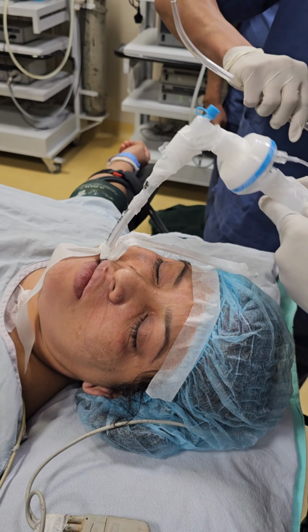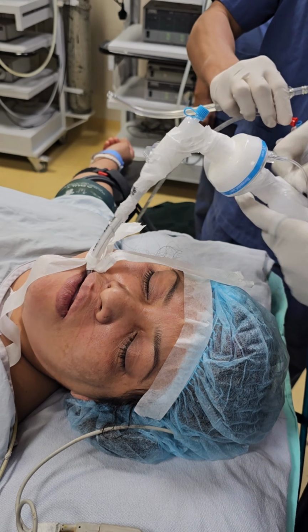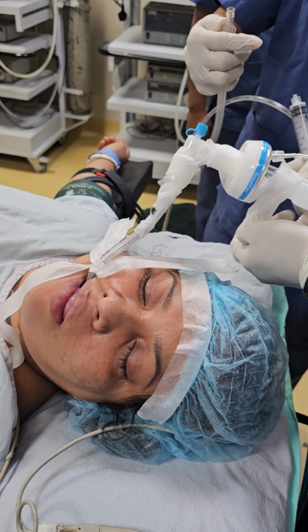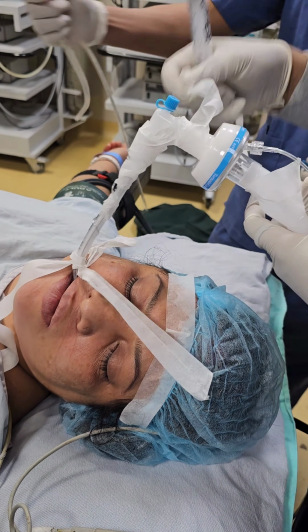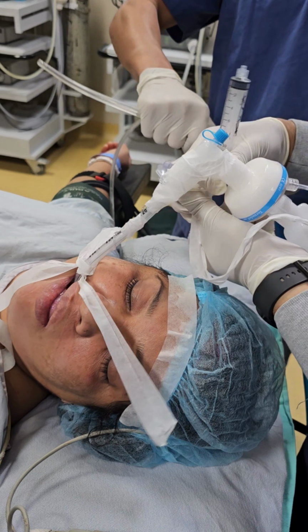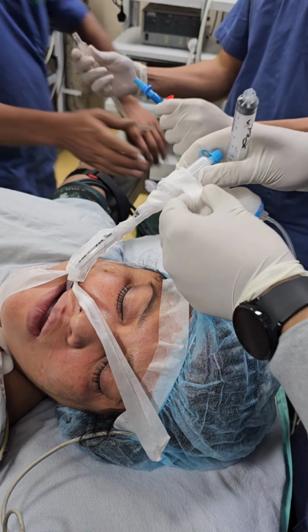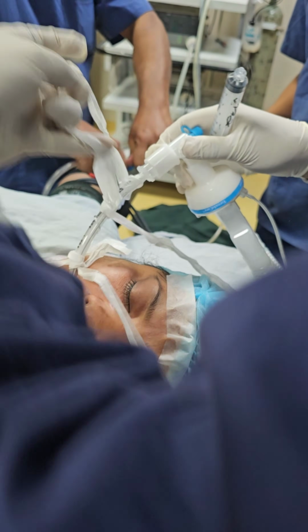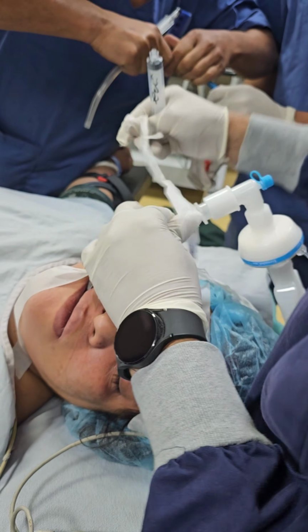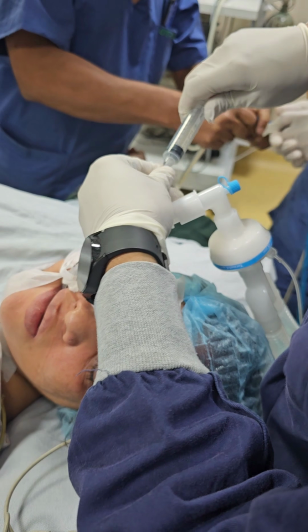Now we are going to extubate the patient. It is very much fortified to prevent any disconnection during the operation. Okay. After removing all these micropores, we are going to extubate the patient from her glottis. And we are seeing the patient is biting. There's some bucking reflex.